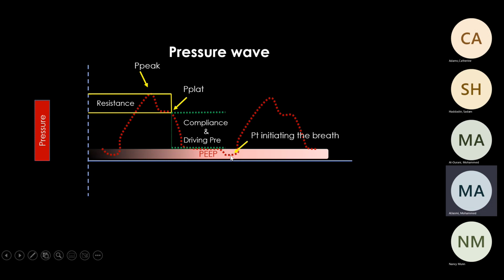However, if the patient initiates the breath, it doesn't mean that breath is not assisted by the mechanical ventilation. The patient just started the breath, but the rest of the breath was controlled by the mechanical ventilation. And the first time in here, we said the inspiratory flow time, the inspiratory pause, and the whole thing is the inspiratory time.